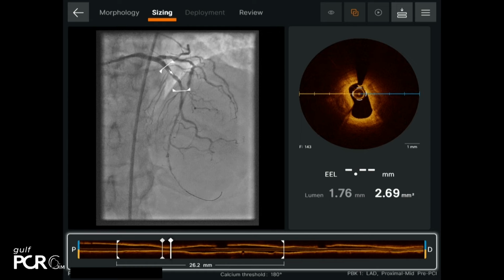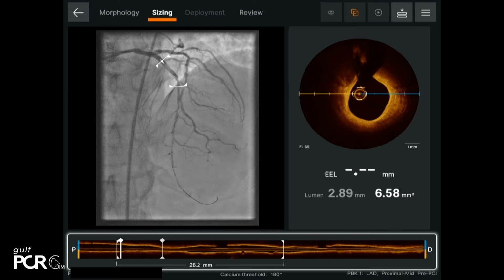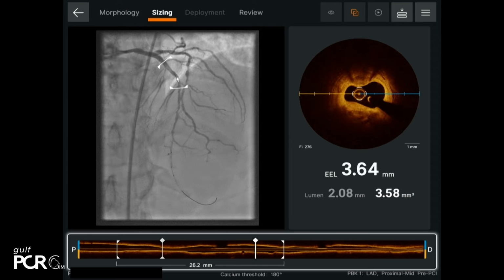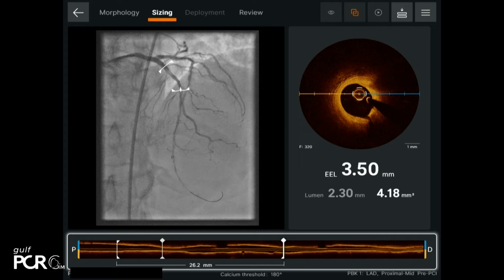And then what we did is we went ahead and measured the proximal part, our landing zone, which is going to be here. We can see the vessel here is almost 3. And the distal segment was, as we said, we'll do spot stenting. You know that it's going to be a disease segment, and this is a healthier segment in between, and it's about 2.3, and we upsize it by a quarter. So the stent size here is going to be 2.5.